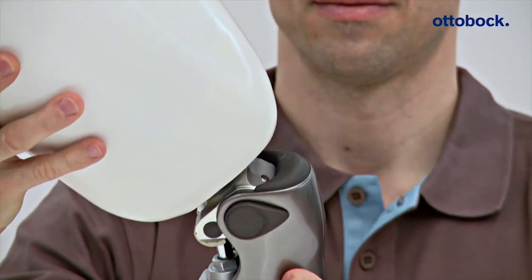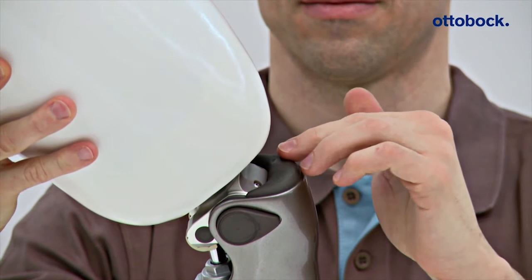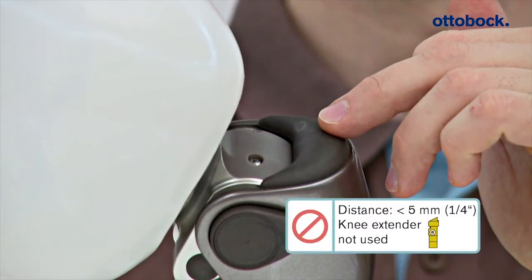If, as in this case, the specified minimum distance is not maintained, readjustment of the distal socket area is required at a minimum.